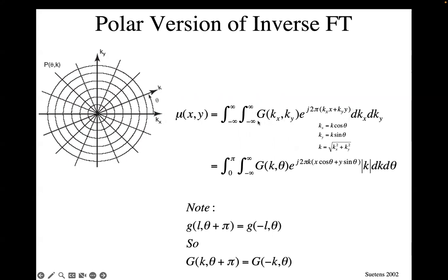if I want to do an inverse Fourier transform of this to get my image back, because I have these radial samples, I need to do it in polar coordinates. I need to use the Jacobian for polar coordinates, which includes this weighting of the data such that it is 0 at the origin and gets linearly larger as we move out to these higher frequencies out here. So this is the accurate formula to create our picture using the inverse Fourier transform of the data we have sampled. This has become known as the ramp filter, and essentially it's an inverted triangle that looks like this that you apply to the data in order to get the reconstruction correct.